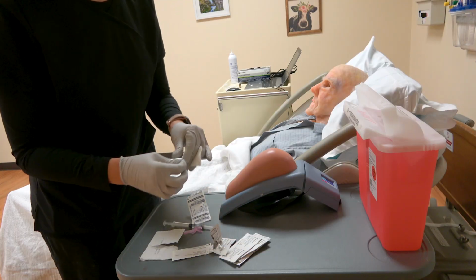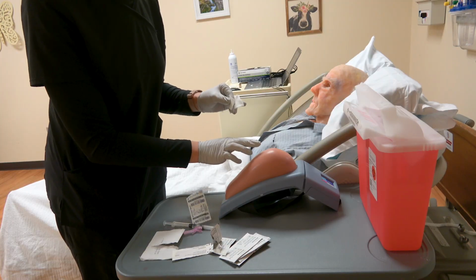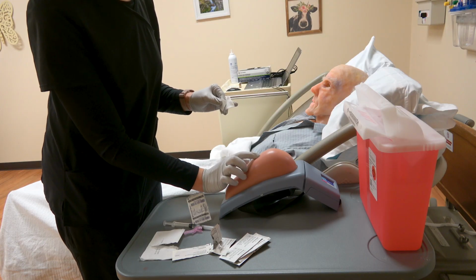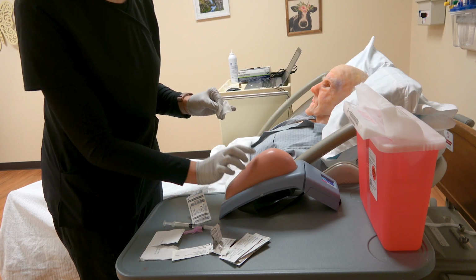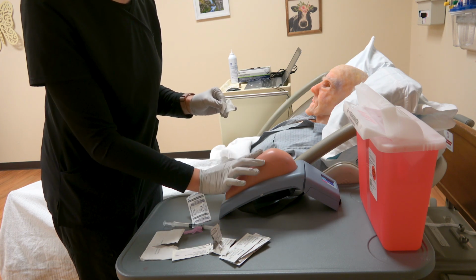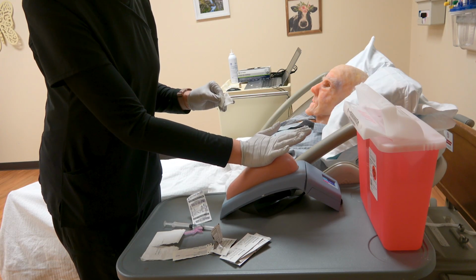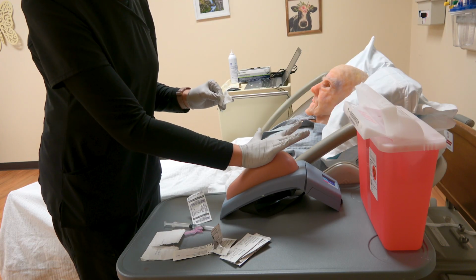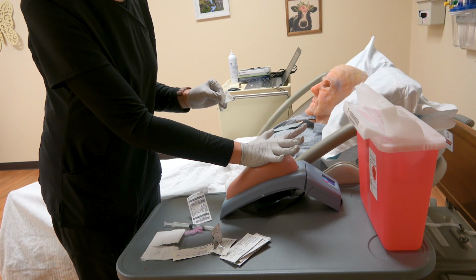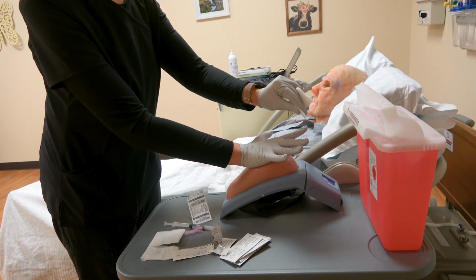For a deltoid muscle, you're going to find the acromion process, and you're going to go 2 to 3 finger widths below that. And you're going to go right in the breadth of that muscle, right in the middle. If you were doing this in the ventrogluteal, you would put the palm of your hand on the ball of the hip joint. So let's pretend this is a hip joint. We're going to put the palm of the hand there, point our thumb toward the groin, our pointer finger will go to the anterior superior iliac crest, and then we'll stretch our 3rd finger over, and we would give it in that triangle portion right there.